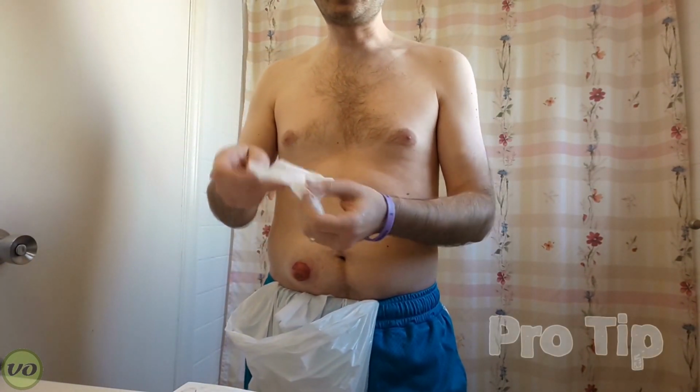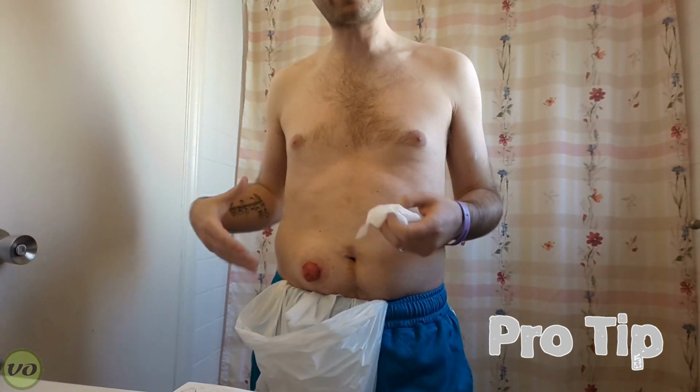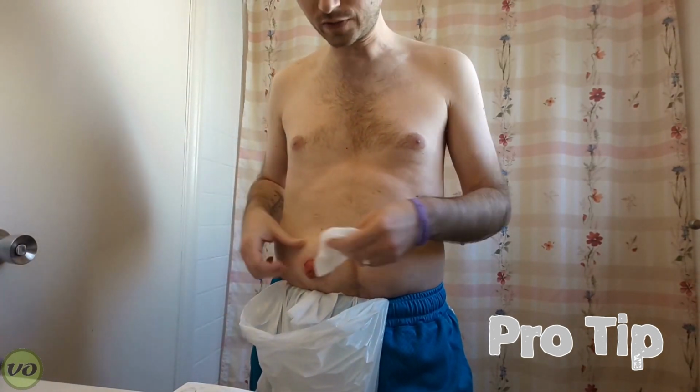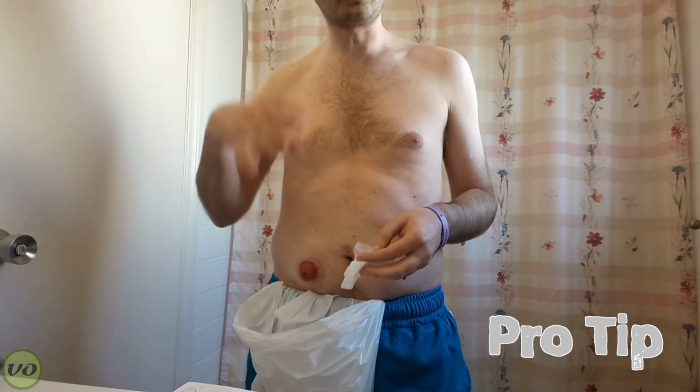But it should be noted that certain creams and moisturizers and things like that you might normally be able to put on your skin, you don't want to put on when you're using an ostomy, or when you have an ostomy appliance, because it will often interfere with the adhesion of your appliance. So once the area is all clear, you do want to make sure that that's nice and dry.